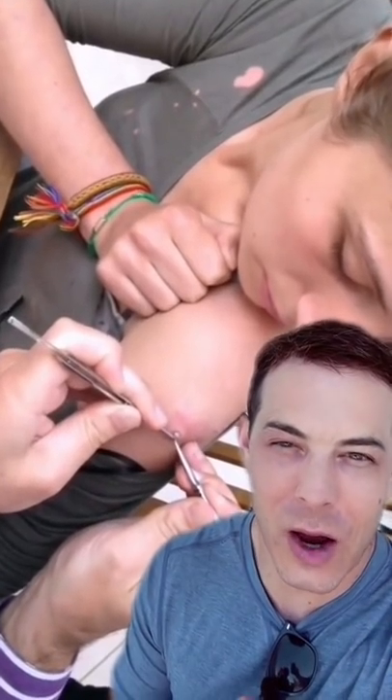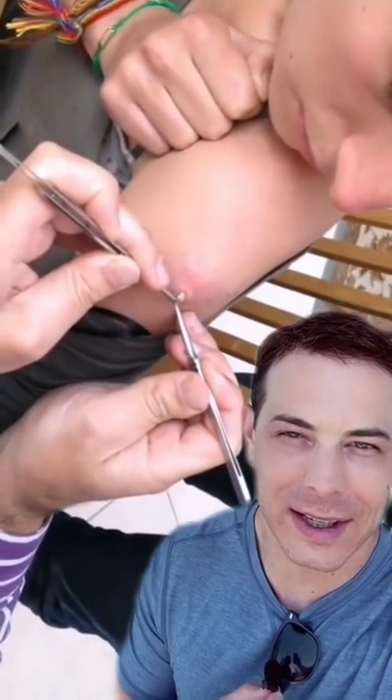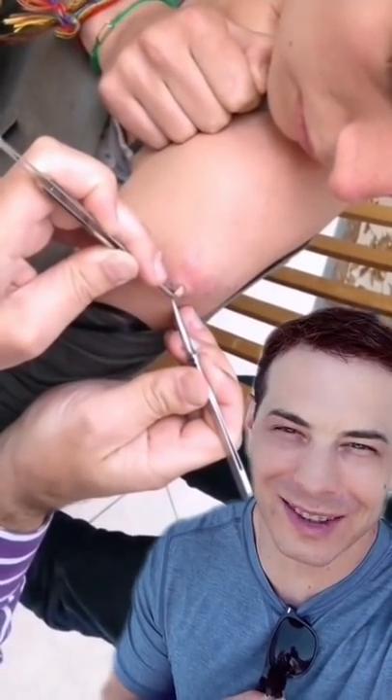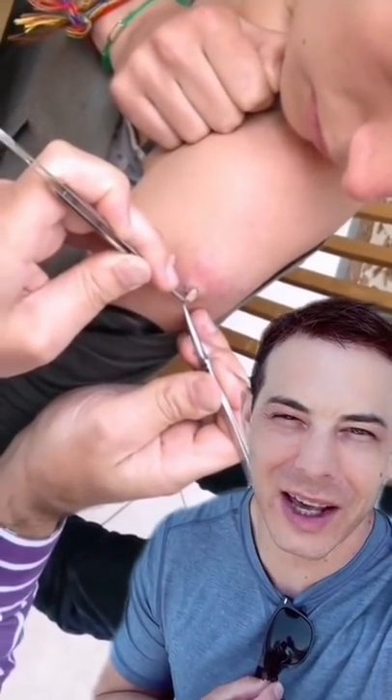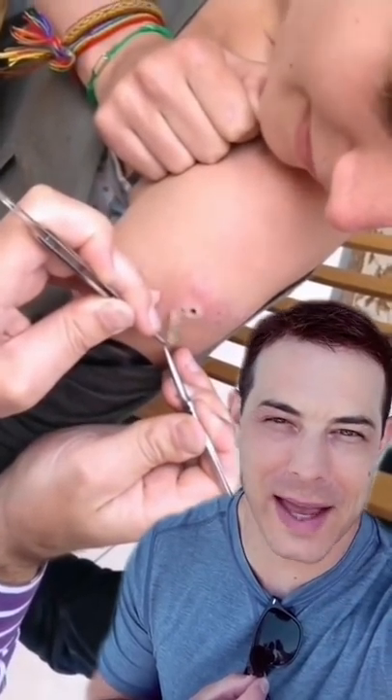Here it comes. Oh, perfect. Except for the no gloves again — not ideal. That's a big one. That's amazing!